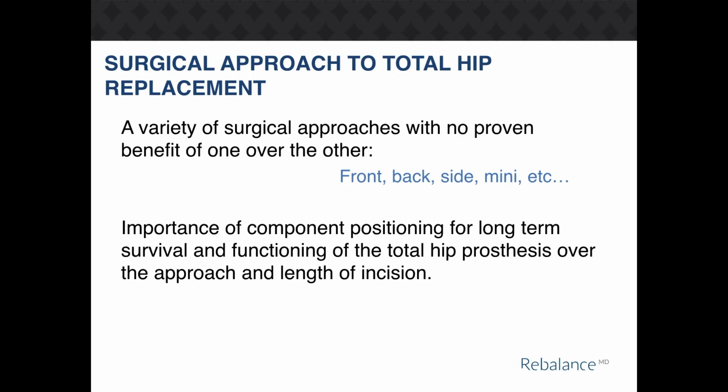There are a number of surgical approaches to total hip replacement surgery. Not one approach has any proven benefit over the other. Proper component positioning is important in assuring the long-term survival and functionality of your hip prosthesis. This will be prioritized over the approach and length of incision.